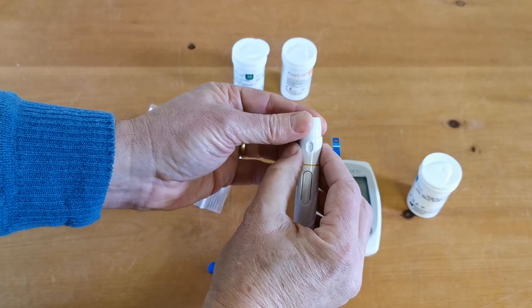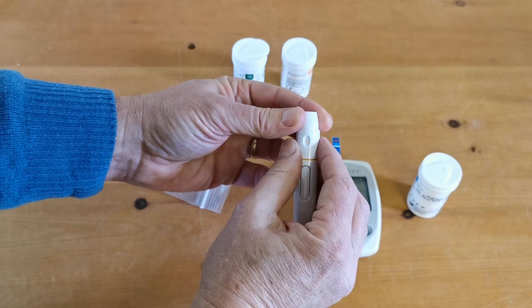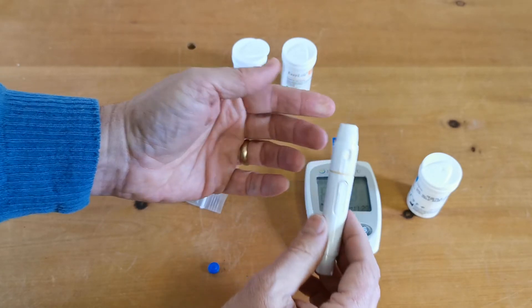One is the shallowest setting and six is the deepest. Because cholesterol requires a good sample of blood, we're going to go for five or six on this lance.